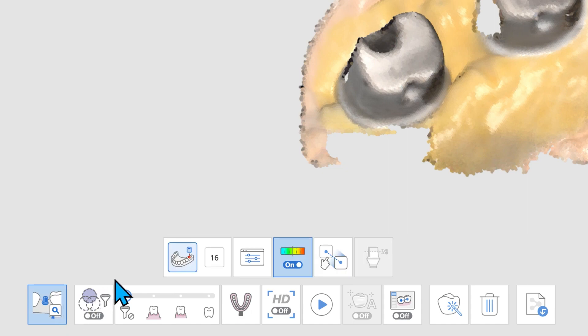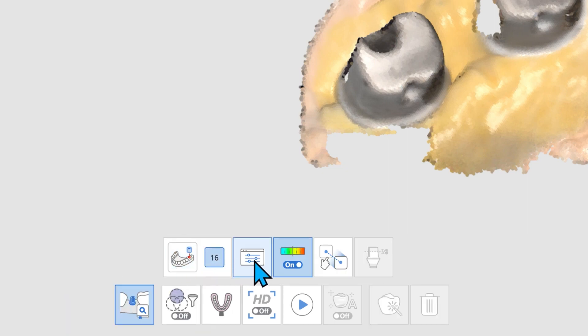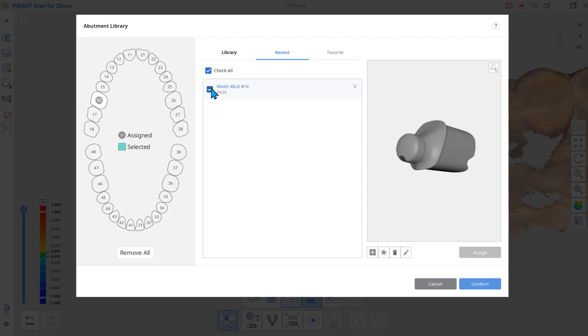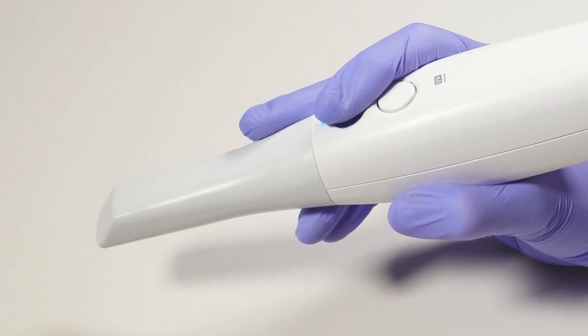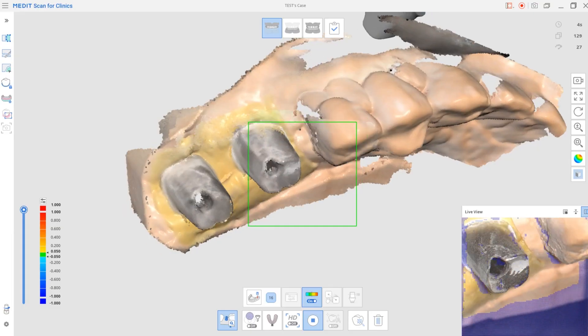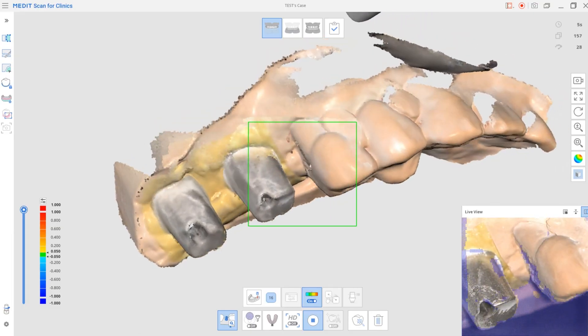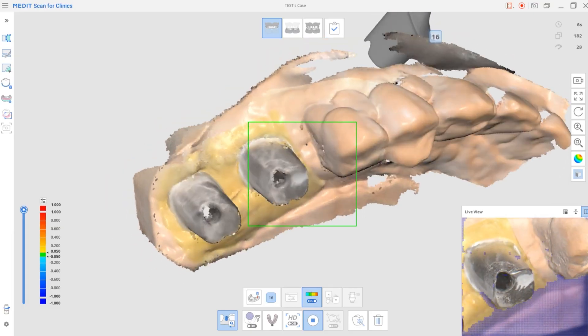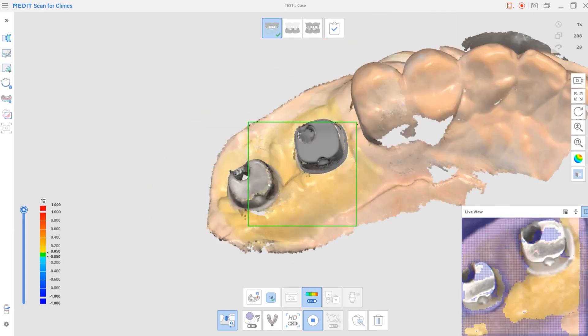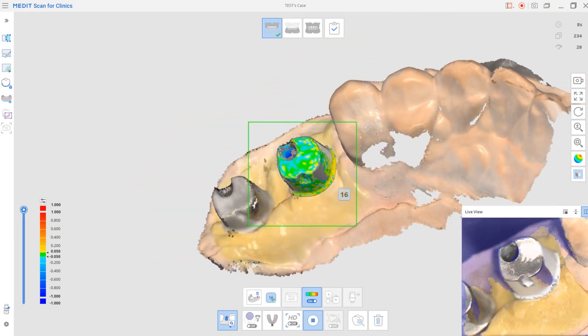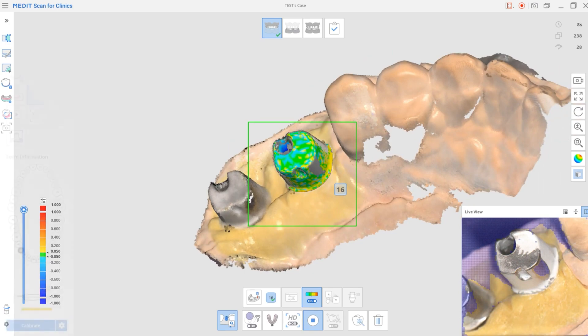You no longer have to request library files from the labs. Scanning is also faster and easier than ever since you don't have to scan the entire shape of the metal abutment.